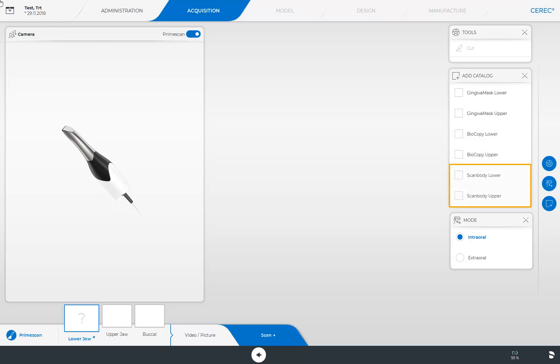Below that, we find the scan body lower and upper jaw image catalogs. In the case of an implant restoration, the corresponding image catalog is added automatically to the list of image catalogs to be scanned, and it is marked as mandatory. In this catalog, the implant with the positioned scan body and the adjacent teeth are scanned.